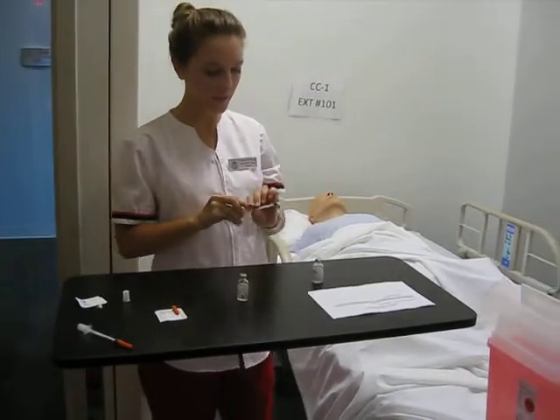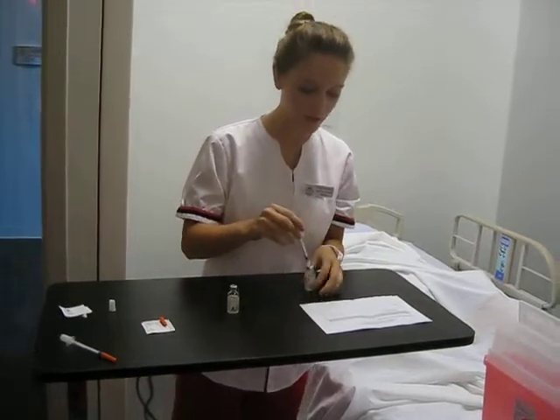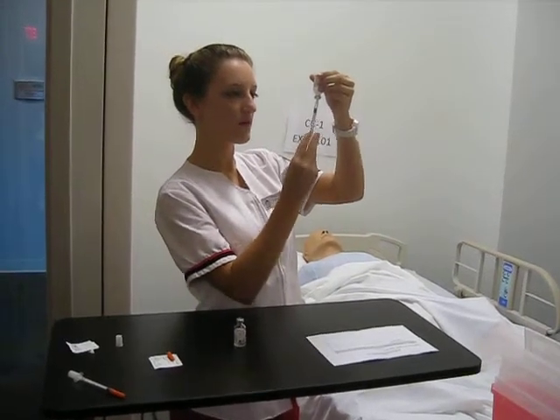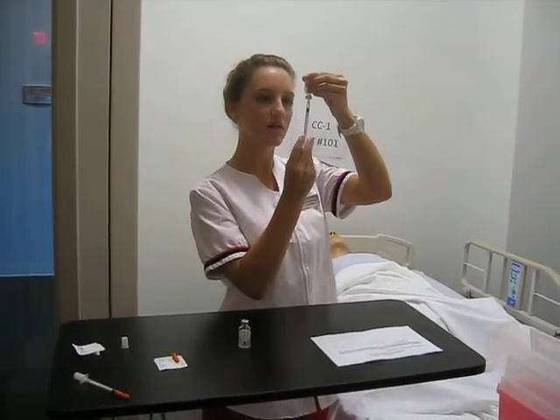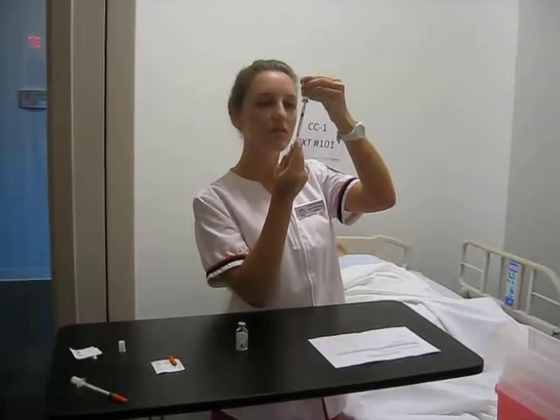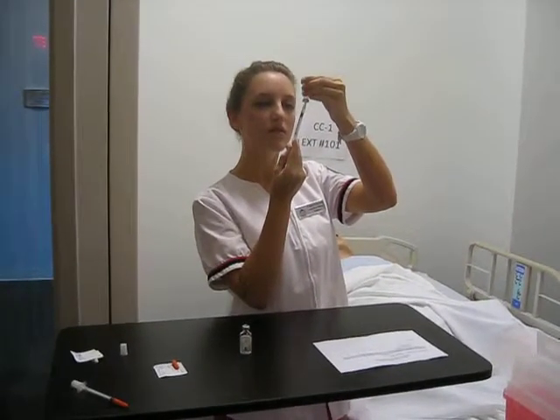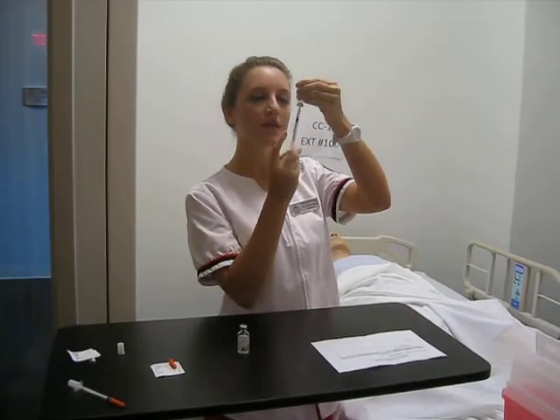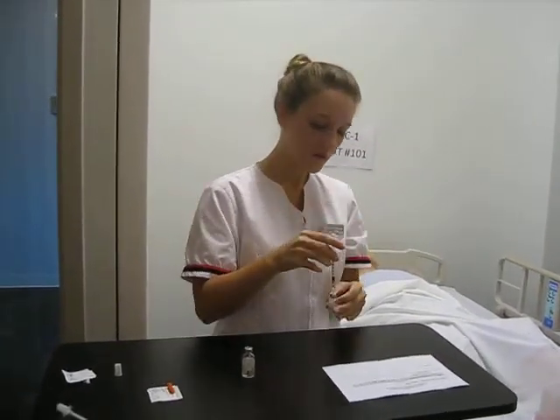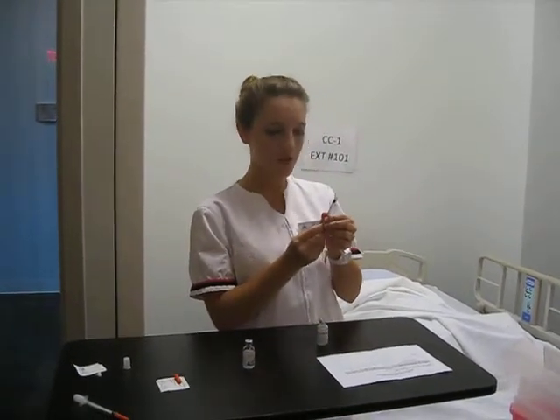Now I will need to get my NPH — this is 22 units — so this will end up coming down to 28 total. I make sure there are no air bubbles, and then I would also need to check this with a registered nurse.